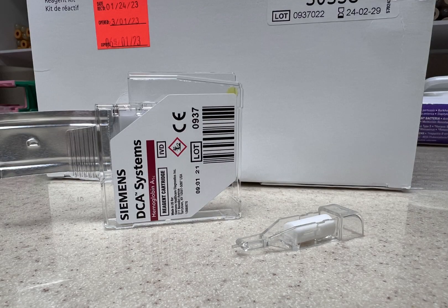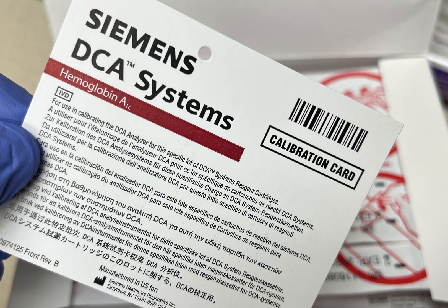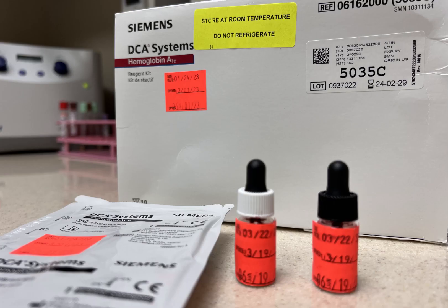Open the box and get a cartridge and a capillary collection device out. If it is a new cartridge box, scan the new calibration card. Swirl the controls before using.